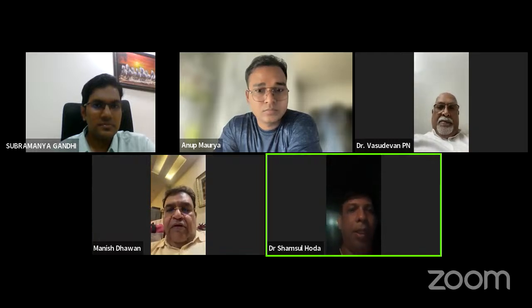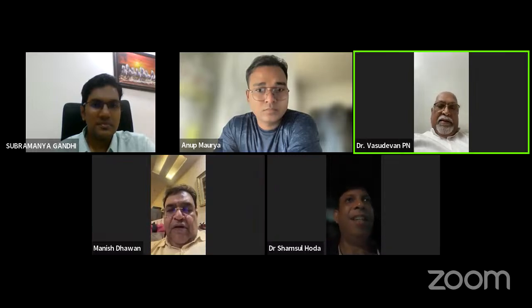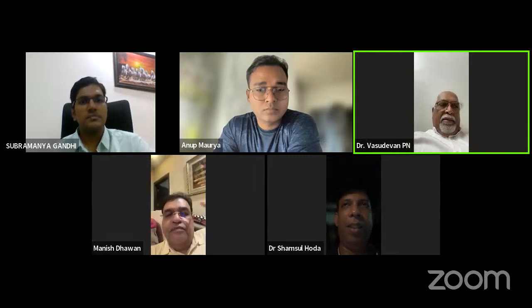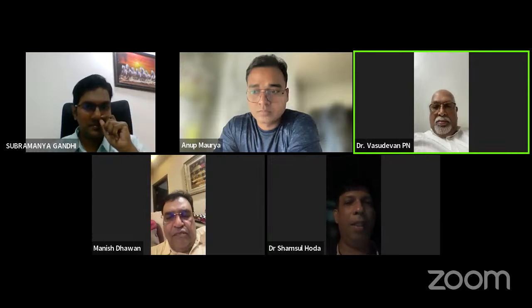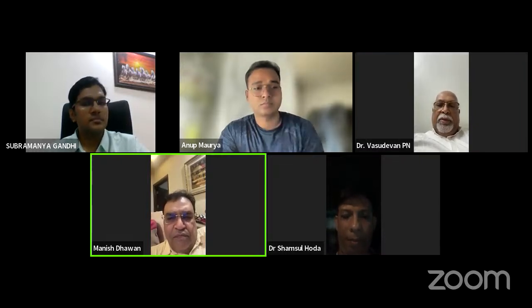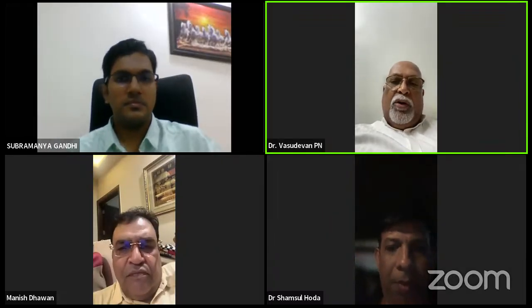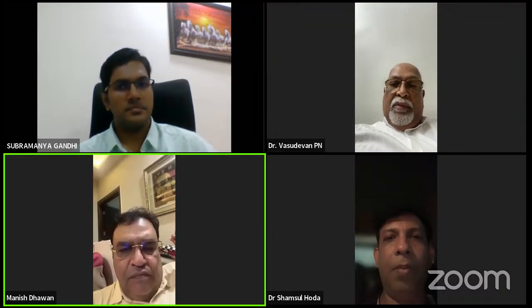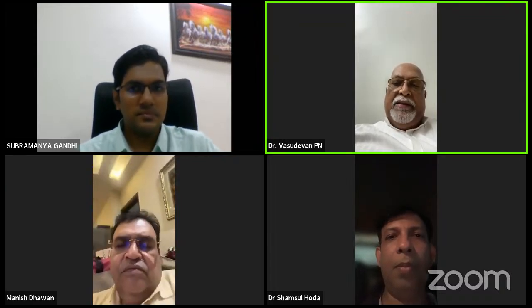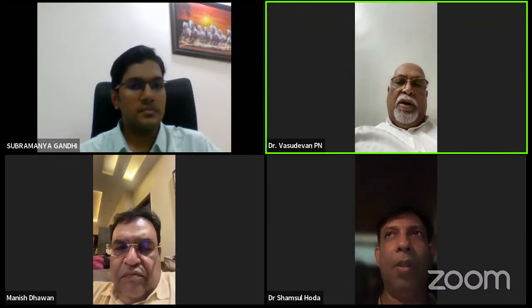Yeah, Manish. Vasu sir, good evening, sir. What he is talking about is the proximal tibia. Compared to the diaphysis, it's a weak bone, so it is better to go for isoelastic fixation. Isoelastic means wires are more flexible. That is why even in old age patients, in osteoporotic patients, it stays longer, because the wires are equally stabilizing to that metaphyseal area. Whereas in the diaphysis, pins are much stronger and more lasting.